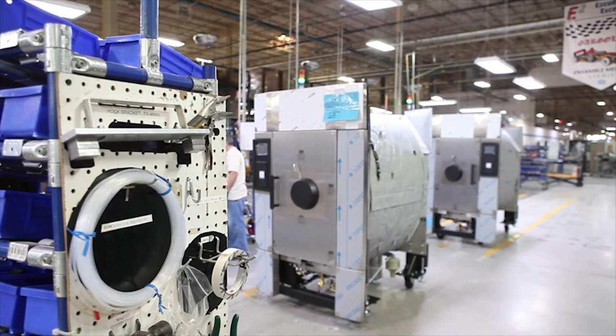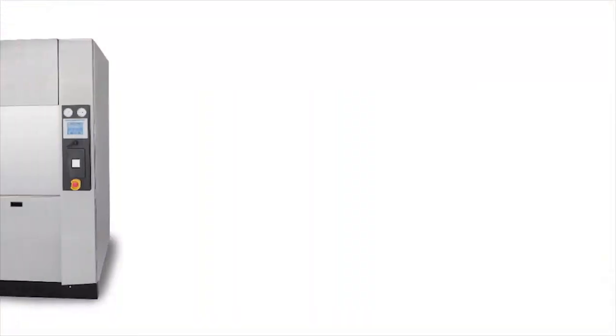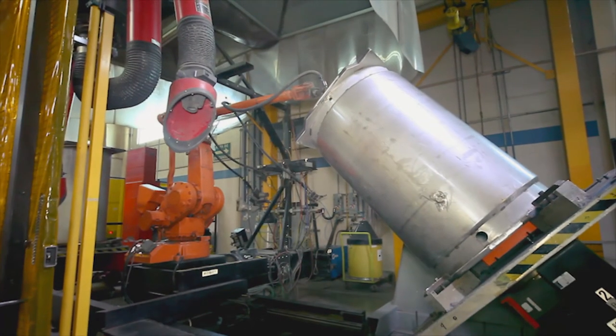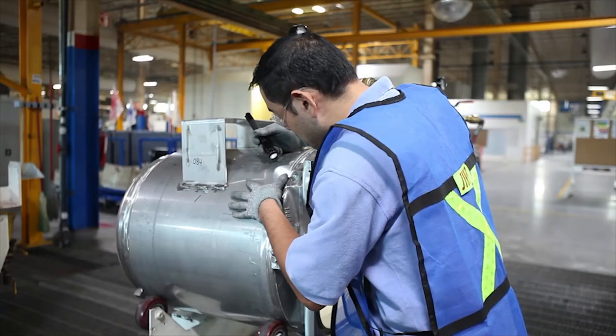The AMSCO Medium LS series is manufactured in an ISO 9001 certified facility and is tested for conformity to applicable standards such as ASME, PED and CELO. The chamber and jacket are manufactured from 316L stainless steel for maximum corrosion resistance and durability.